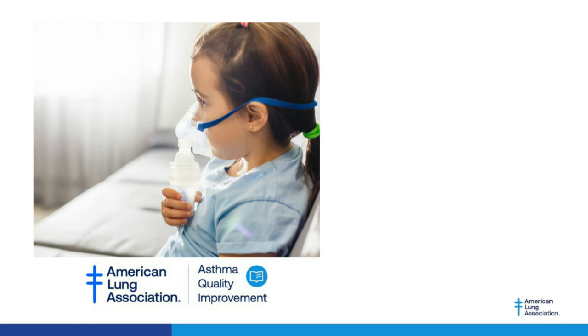Well, it's safe. Multiple studies have suggested that even in our COVID wards, the PPE is protective, right? And I'm assuming that you're doing some sort of screening so that there's probably low prevalence in your area, but also the patient probably screened negative for fever and cough. Well, I shouldn't really say cough because our patients are coughing. Pulmonary patients cough a lot, so it's hard to differentiate between maybe a COVID cough and their normal, say, asthma or COPD cough. But anyway, it's safe to do spirometry for your staff members.